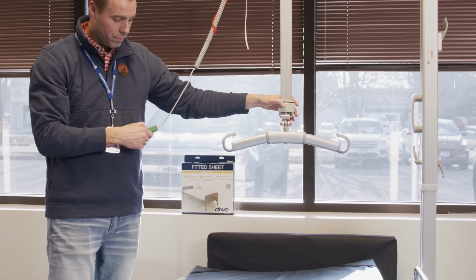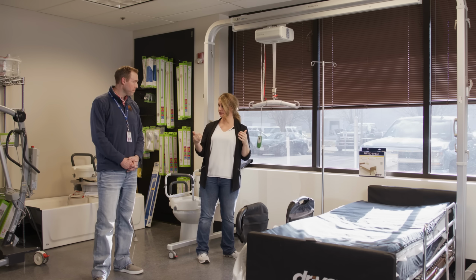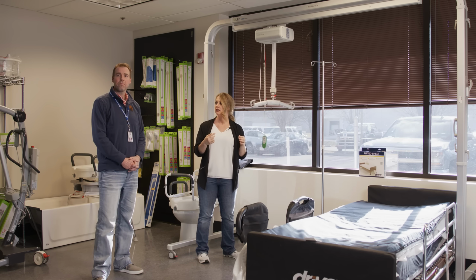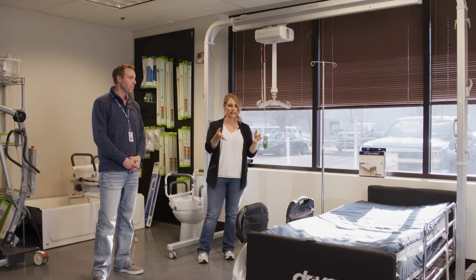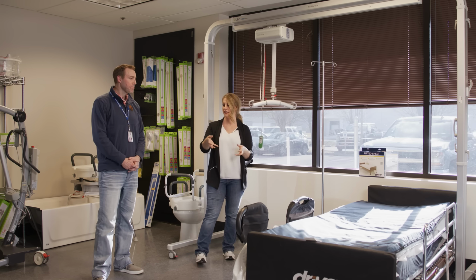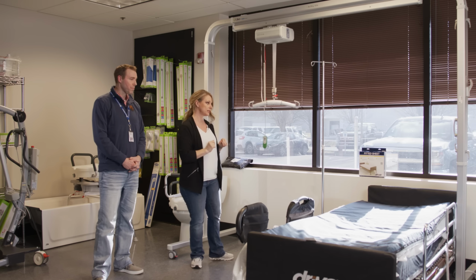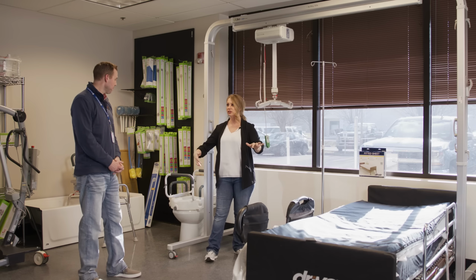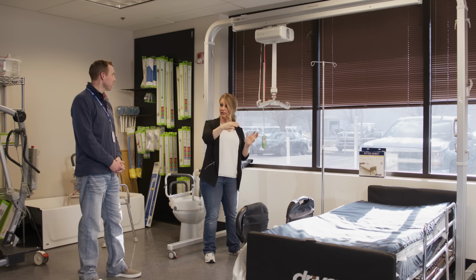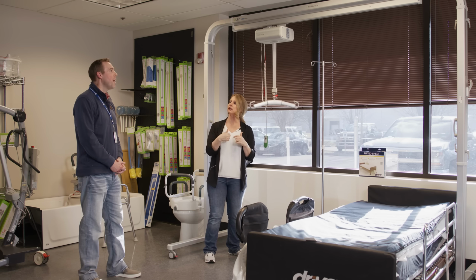The reason why I wanted to bring it up is because for Matt's place, Coeur d'Alene House, we put in a ceiling lift on one track. We thought that was a really great option. Turned out it wasn't, because the family needed more mobility to move the person around, right? And that track really kind of just stuck in one spot. But what I like about this is this looks like it's really easy to move. So if you needed to kind of move to get in a better position, you could do that. Why don't you tell me and I'll stop talking.